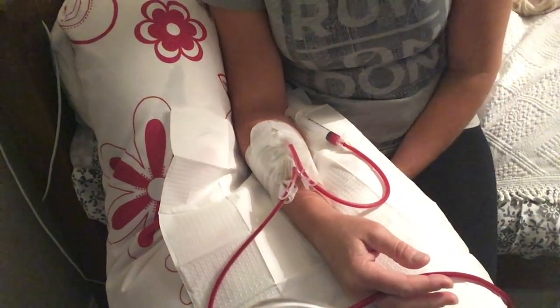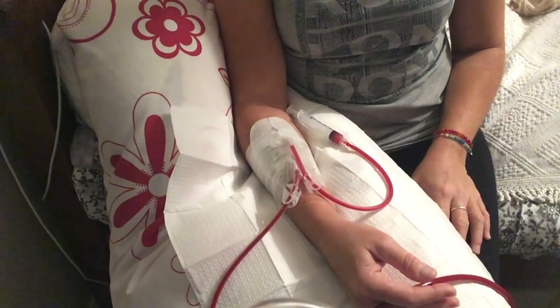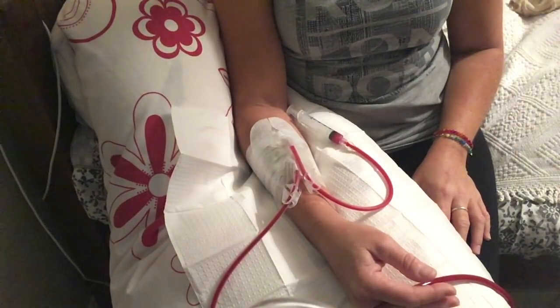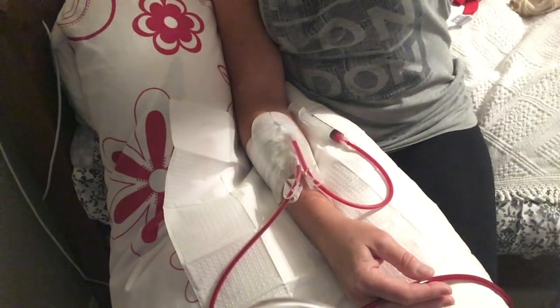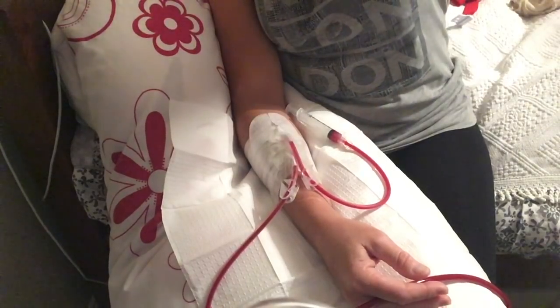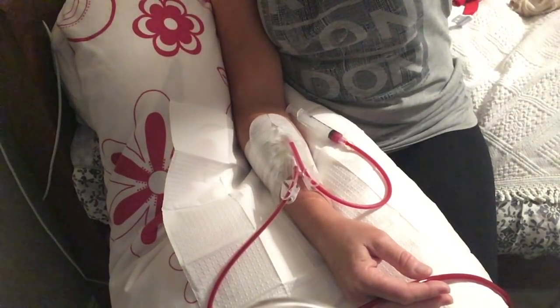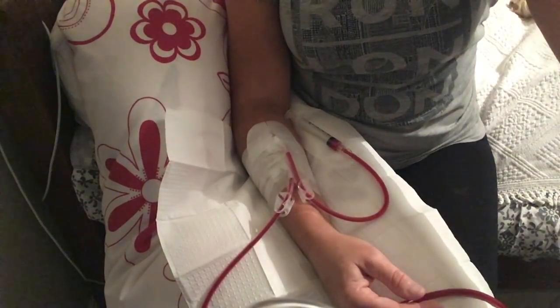I'm just waiting for my blood to pass through the dialyser now. It's detected blood in the air detector, so I'll just stop the pump while I connect the venous needle.